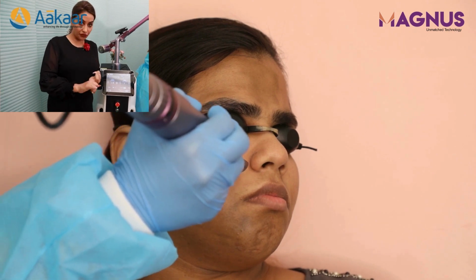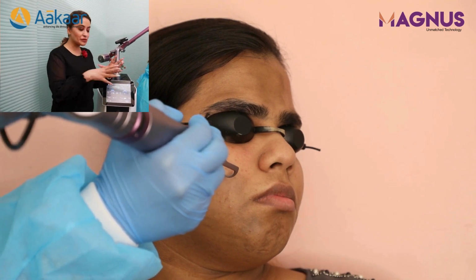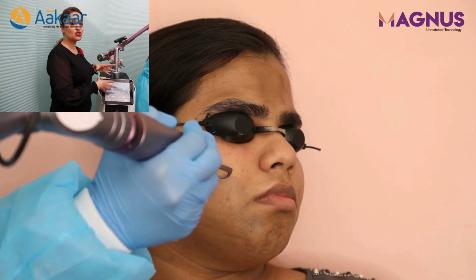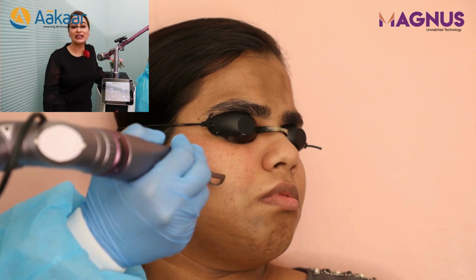Second, you can even deal with epidermal pigmentation like melasma or freckles. Then deep dermal birthmarks and pigmentation like nevus of Ota, Hori's nevus, or even dermal melasma. Of course, melasma management is totally different, but a Q-switch has a very important role to play in it. And what is good about this machine is that there are hardly any consumables. So as young dermatologists starting your practice, I've always believed laser hair removal to be number 1 and Q-switch Nd:YAG to be the number 2 machine you need to have.